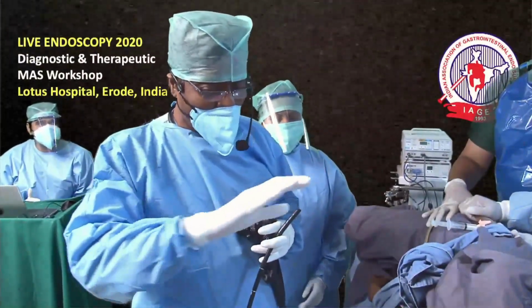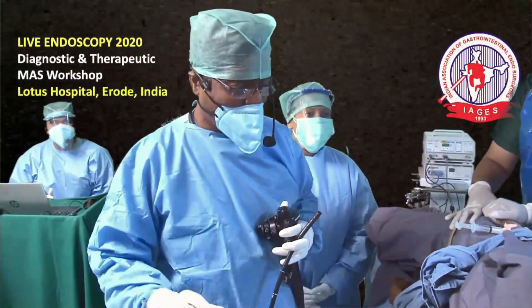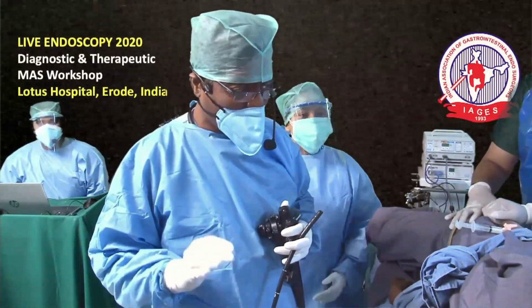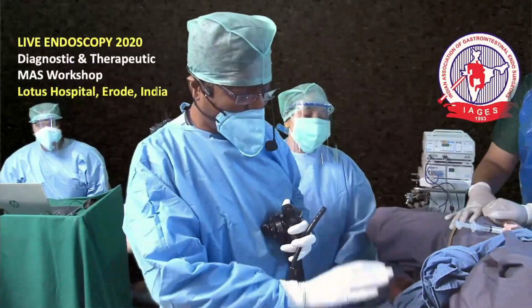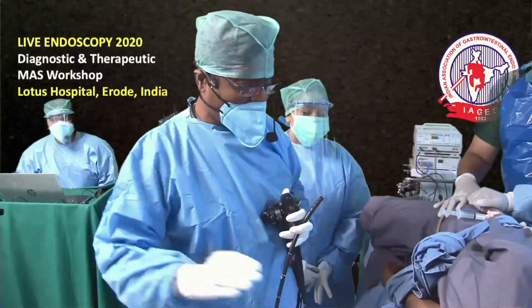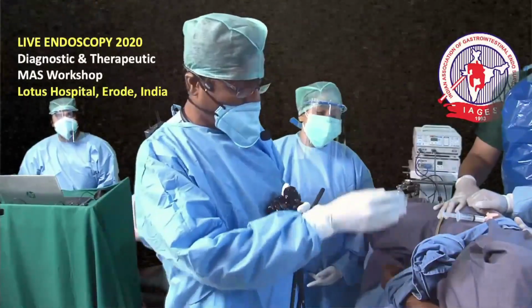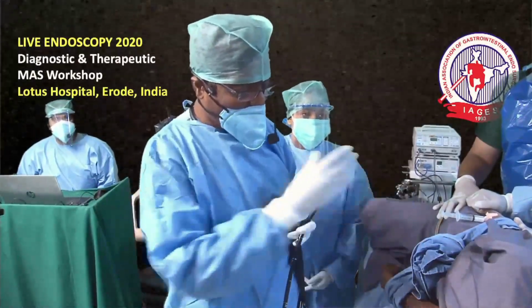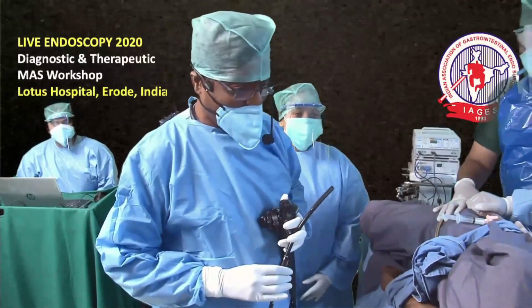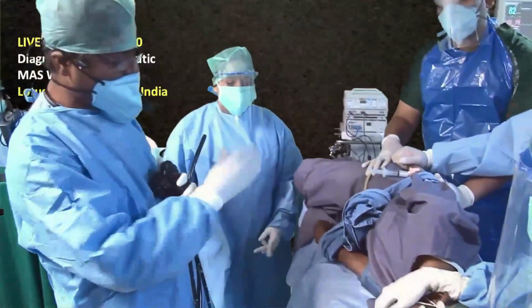If you have a panoramic view of the endoscopy room, endoscopy is essentially teamwork, and there are 3 important people here, in addition to me. Of course, one to keep the patient comfortable and the airway under control, you need somebody vigilant. If it is done in the outpatient setup, you have a staff nurse who will monitor. We have the luxury, and we also have our anesthetist here, Dr. Thirumalai Raja, who is going to give conscious sedation. Next, of course, is the head end. We have a staff to control the mouth guard, and I have an assisting staff nurse, Suryakala.